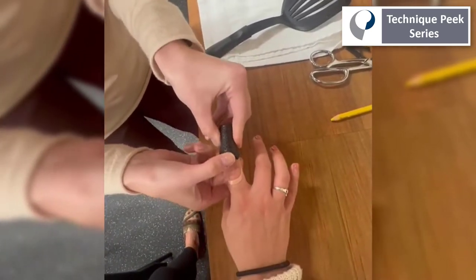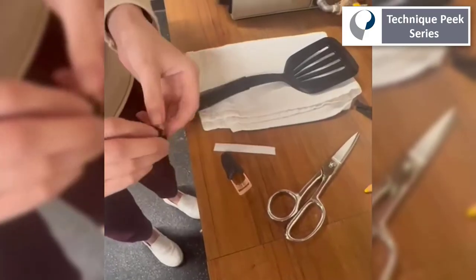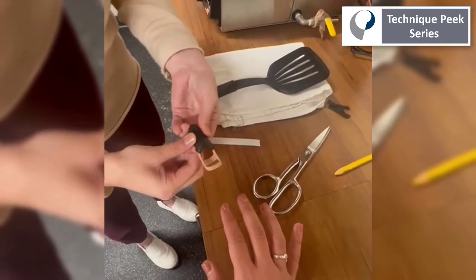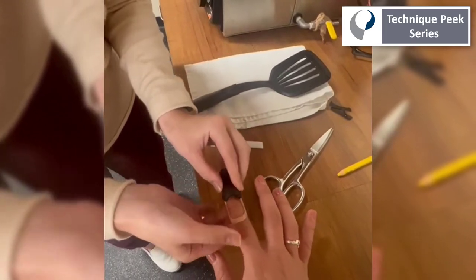And lastly, she will mold the distal part of the splint to maintain the DIP joint in extension. Adding one strap to secure the DIP joint in extension will complete the splint.